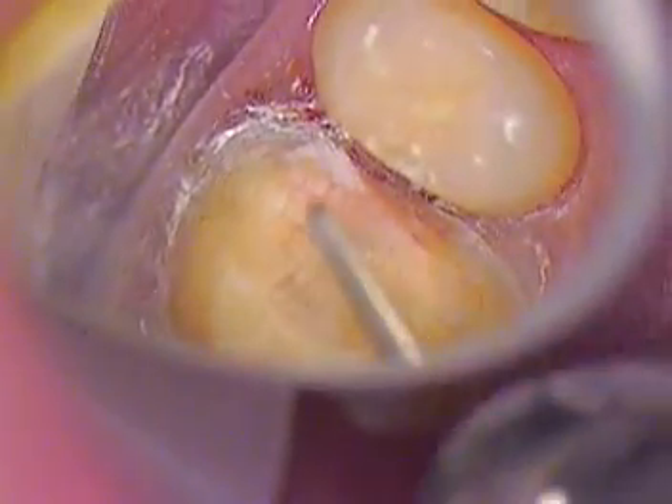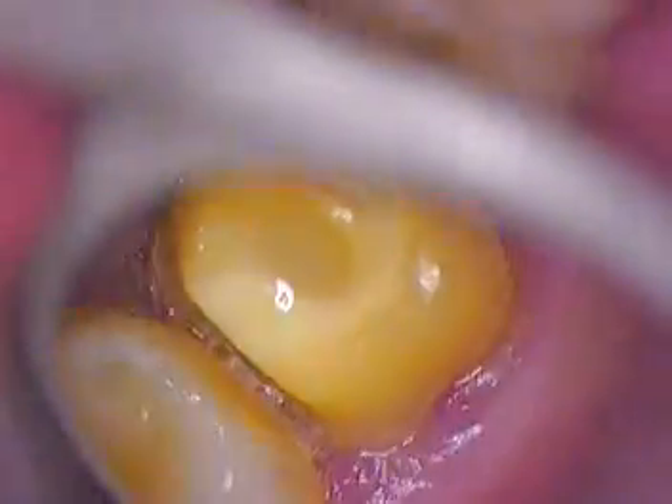We'll just hit that with some water now and then we'll rinse it. Oleg wanted to forgo the video eyewear, but he wanted me to record this for YouTube, for all the viewers out there in the dental world, and also patients like himself that could use a little more education on crown preparation design. We'll dry that tooth now and we're moving right ahead, getting really close to finishing and polishing.